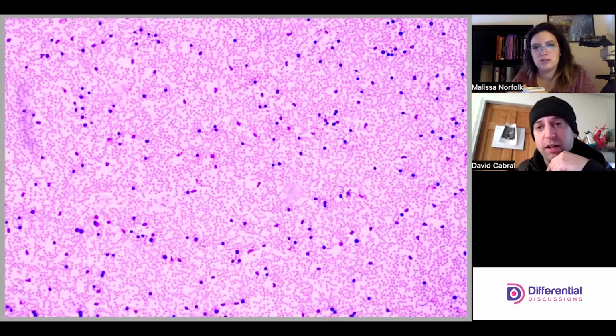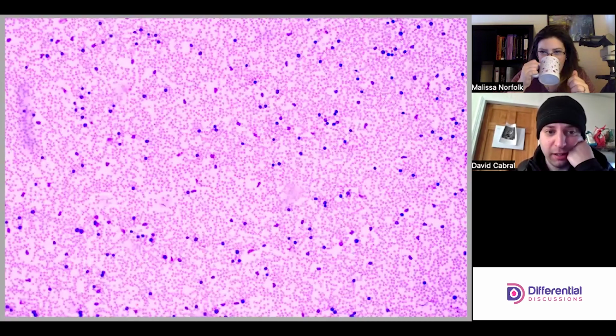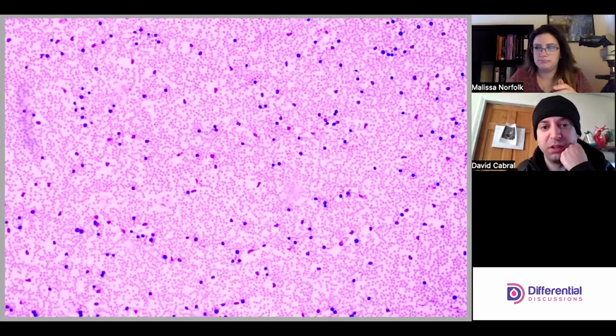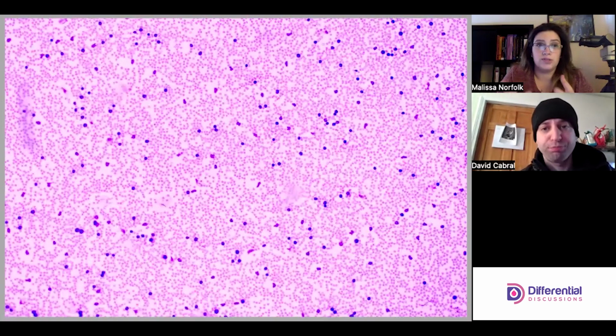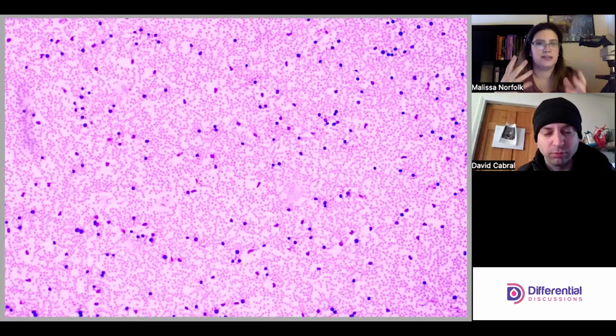We're starting on 10x, which is where I always like to start. I try, as I might, to convince students: 10x, 10x, 10x. It's a really, really valuable objective to get your bearings on. Do you want to talk about what you see and what we're looking for? Yeah, 10x for everything, but notice that in every diff, we don't start on 10x. For the videos, we'll start right in where we're looking, but we wanted to start on 10x because CLL has a very characteristic classic presentation that you can easily see on 10x.